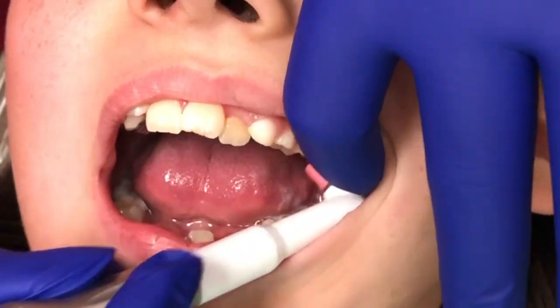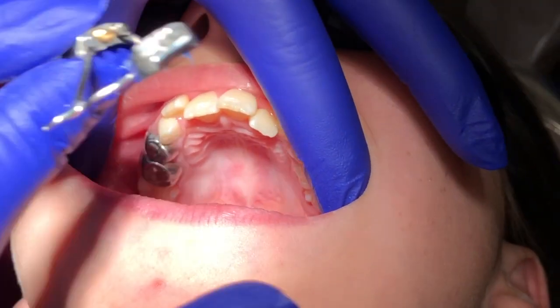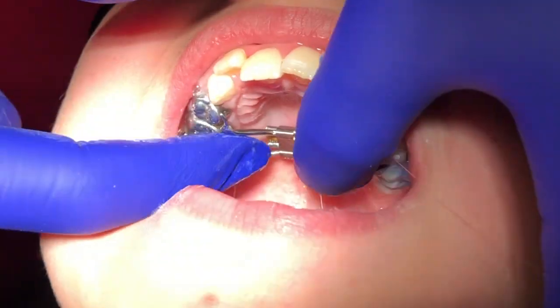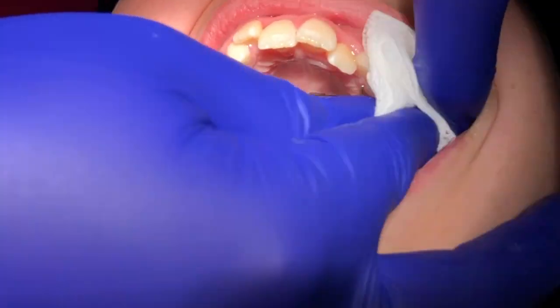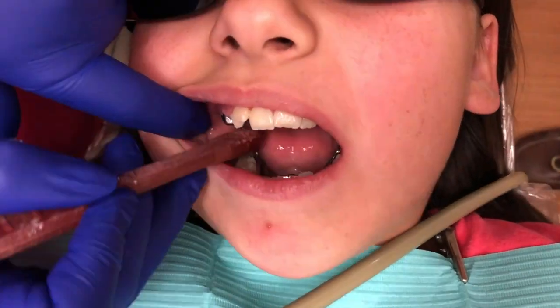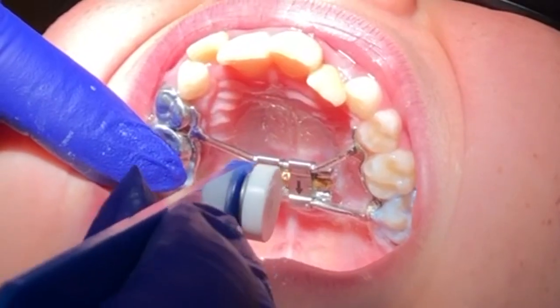The first step is preparing the teeth. We like to polish the teeth and make smooth surfaces. Then we try in the appliance first to make sure that it fits in the mouth the way that it did on the model. Here is a look at the completed appliance once it's been placed.